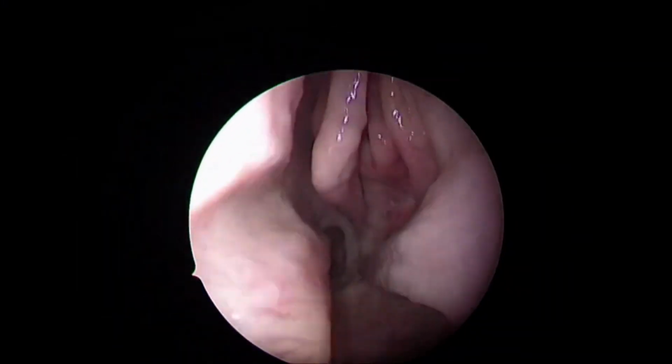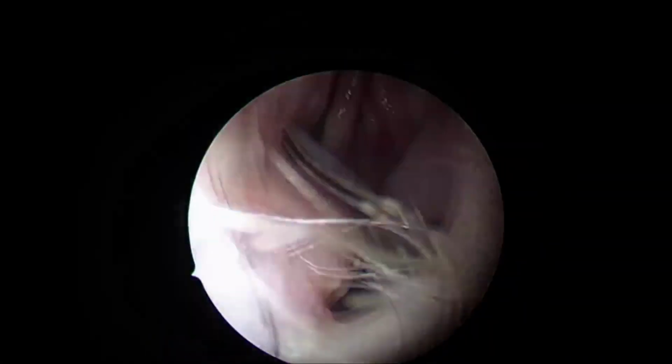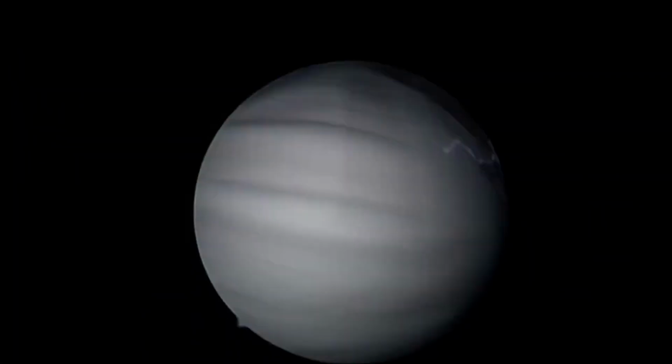So, friends, this is the left side of the nasal cavity. I hope the picture is good. Or let me do a white balance. Just a minute to begin with.